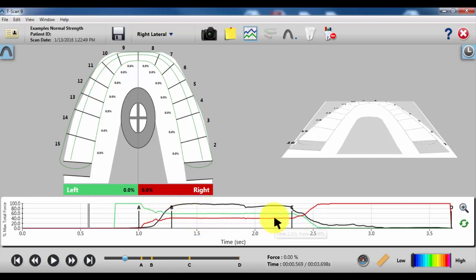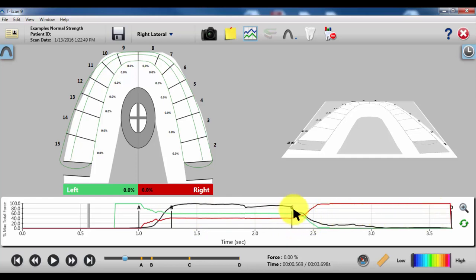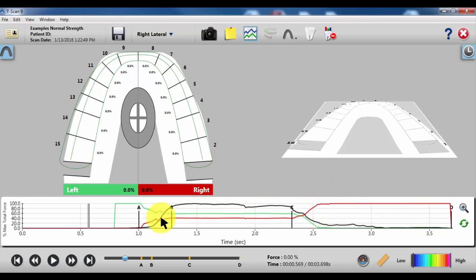When we look at an excursion, we're focused around the C to D area because that's where the teeth are separating or discluding during the sliding motion. In this case, it's a right lateral. But first, let's start on the A to B.